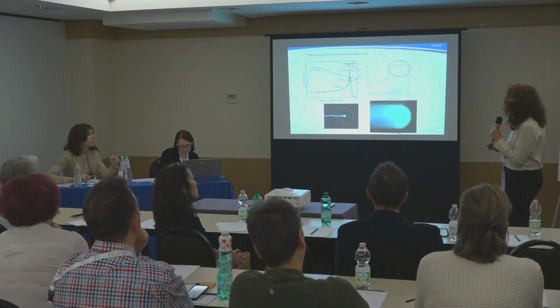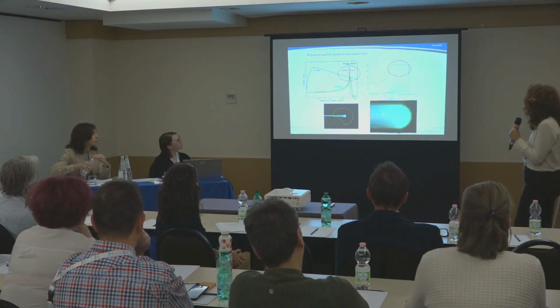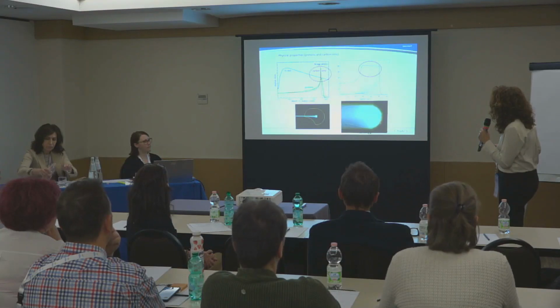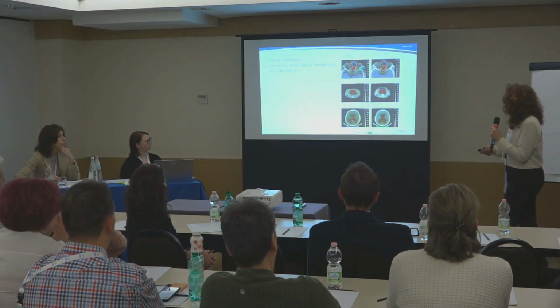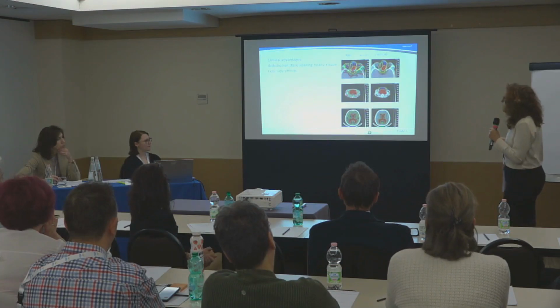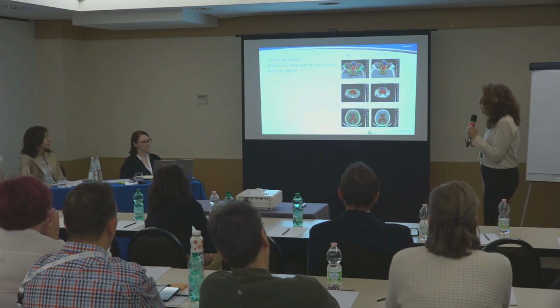So accelerating more particles, we can have a beam covering all the tumor volume at its precise site in depth. So you see the particle beam with high dose on the tumor, low dose on the entry tissue. And the most important thing is the stop of the dose at the end of its pathway. So these properties give us very important clinical advantages, that is dose distribution sparing healthy tissue, and we hope for far fewer side effects, so very low toxicity.